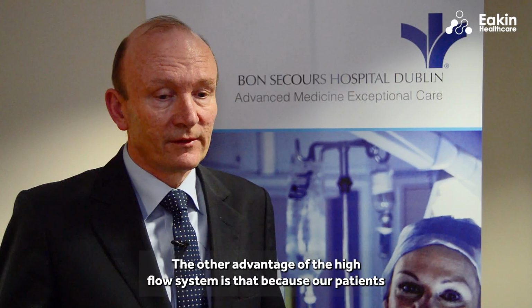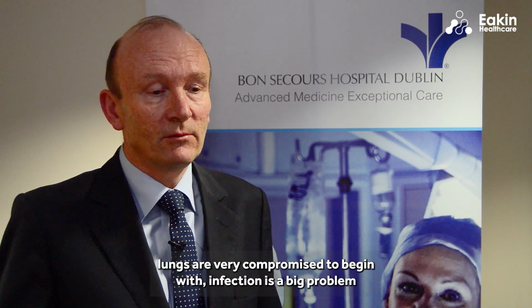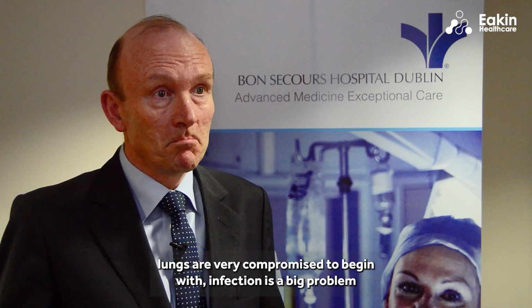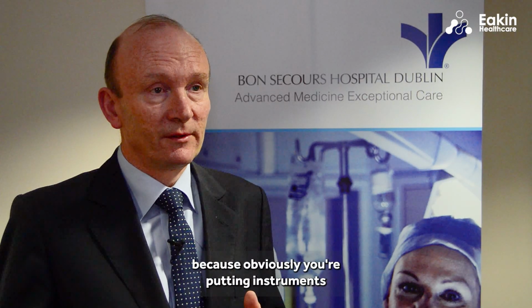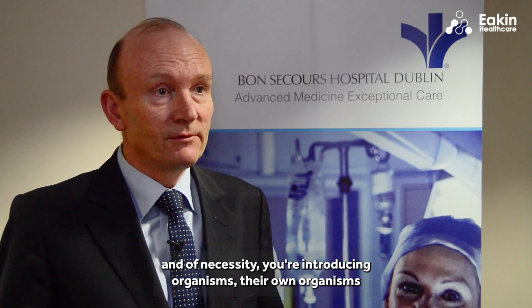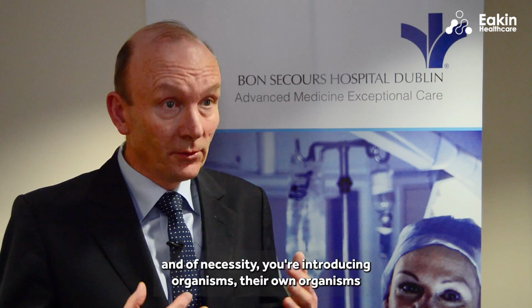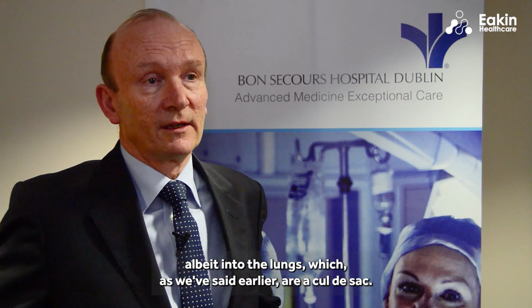The other advantage of the high flow system is that because our patients' lungs are very compromised to begin with, infection is a big problem. Because obviously you're putting instruments through the natural passages into the lung, and of necessity you're introducing organisms, their own organisms albeit, into the lungs, which, as we've said earlier, are a cul-de-sac.